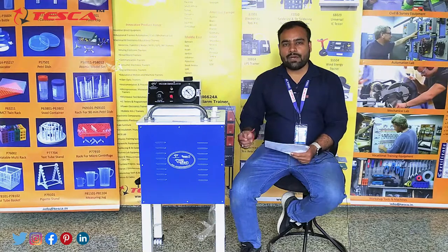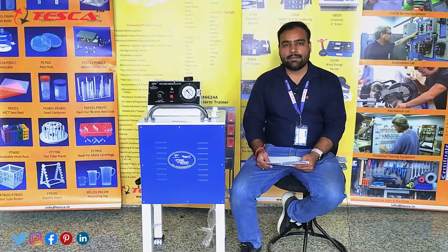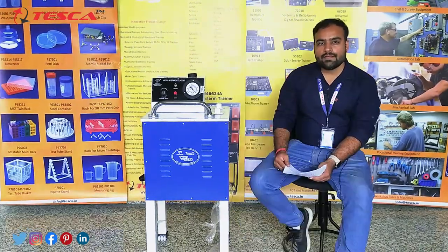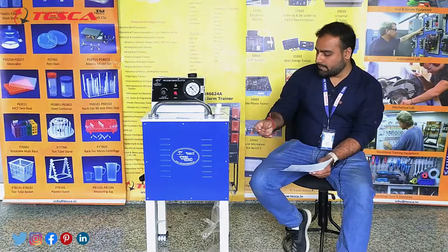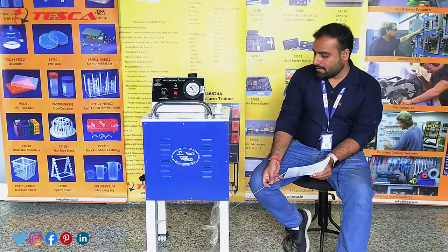Now let us move on to all the parts of this complete machine. We will see what accessories we are offering with this complete setup, and later on we will see the working of this machine as well. Let us discuss the complete fabrication of this body.